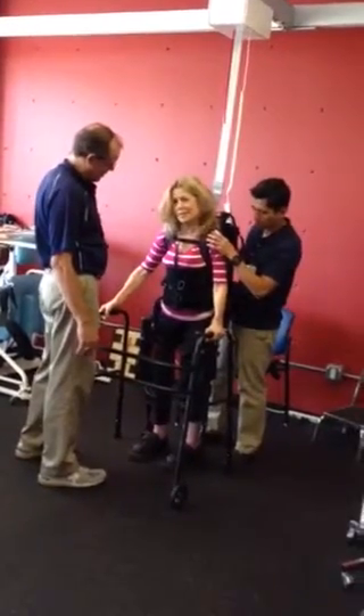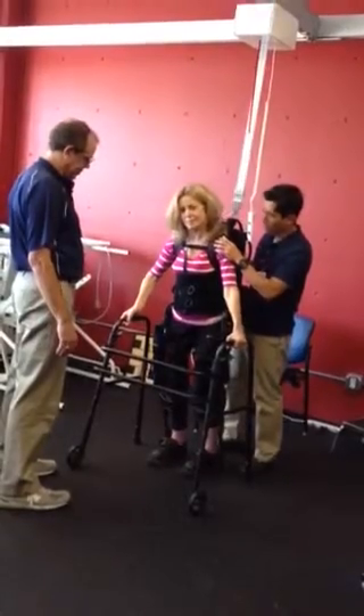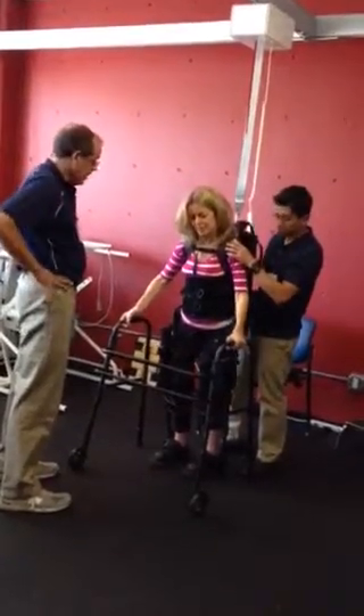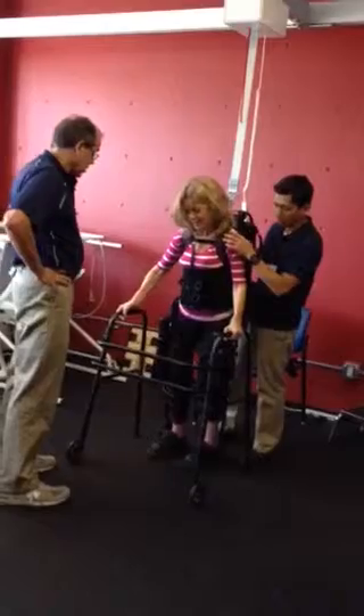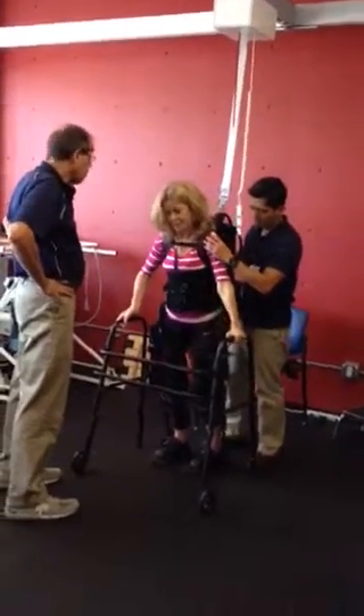Let's just work on the weight shifts. Go left again. Good. And then go right. Can I use my arms? That's what you should do. Use your right arm to push to the left.